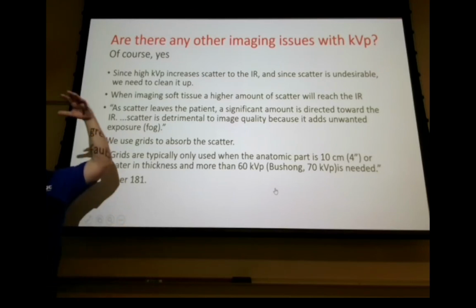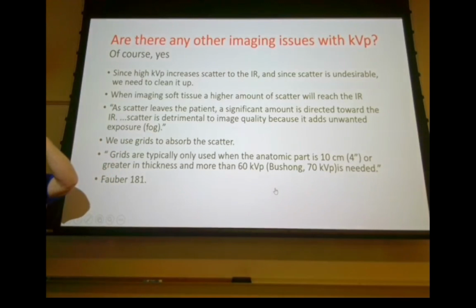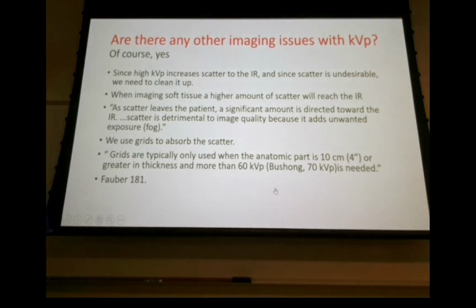Now you got somebody who's 400 pounds. Have y'all had one of these? Yeah. What does their KUB look like? Gray. Very gray, because it's got a lot of scatter. Right. Because you've taken this much tissue, and now you're exposing this much tissue.